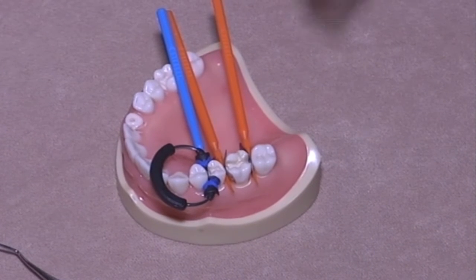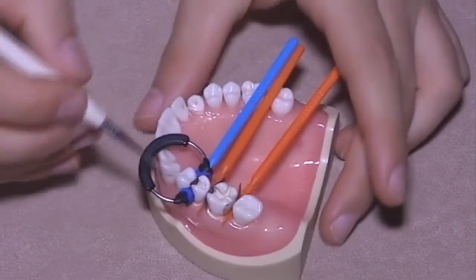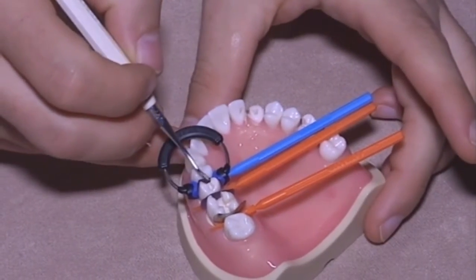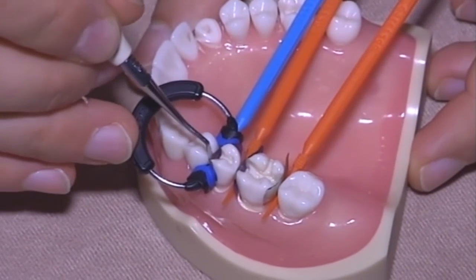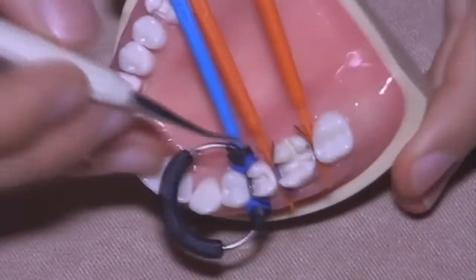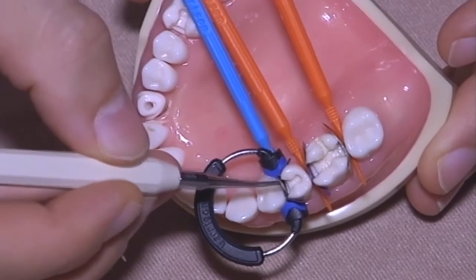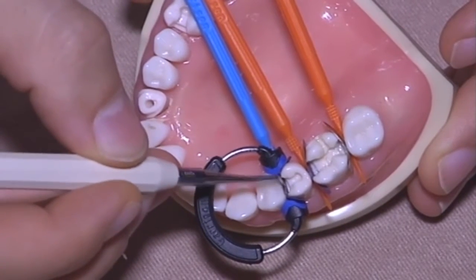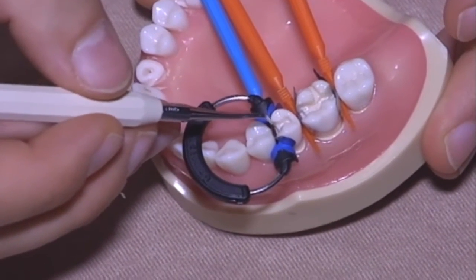Now of course we start with the interproximal wall here. Just check that the shape of the matrix is perfect. So you have to check that it closes even the floor of the cavity, even the actual walls of the cavity.